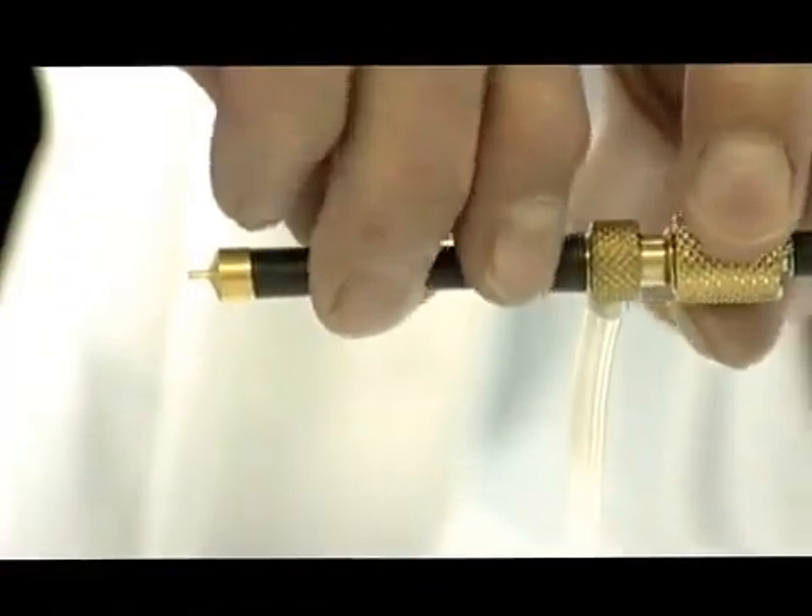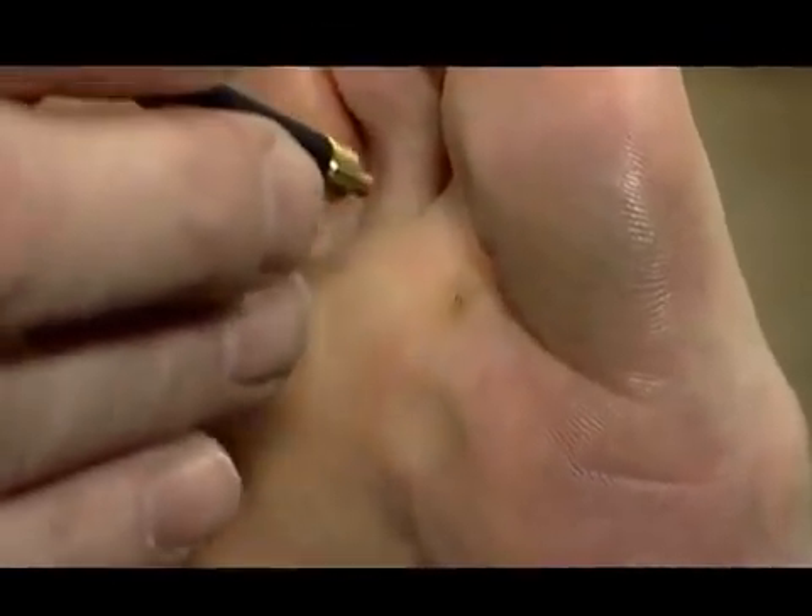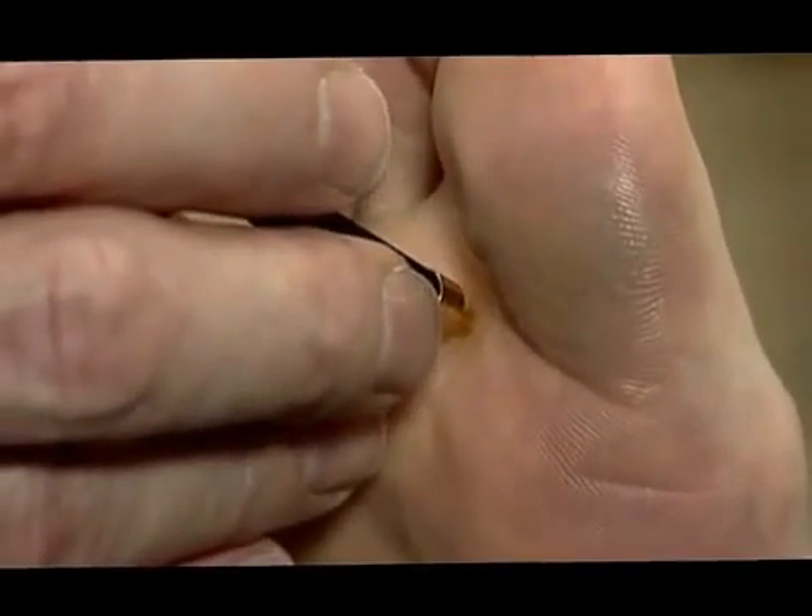This method makes use of a supercooled metal tip which is pressed against the lesion. Select a probe with a tip diameter fitting the size of the lesion.